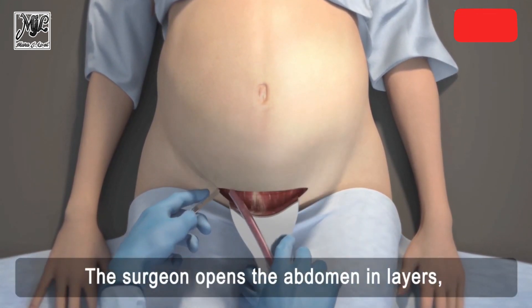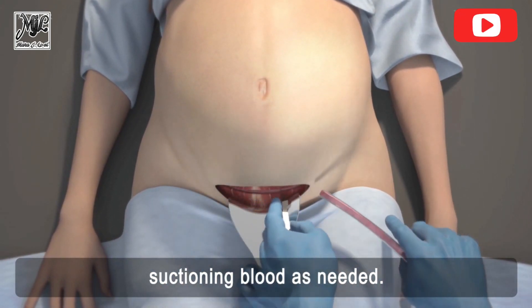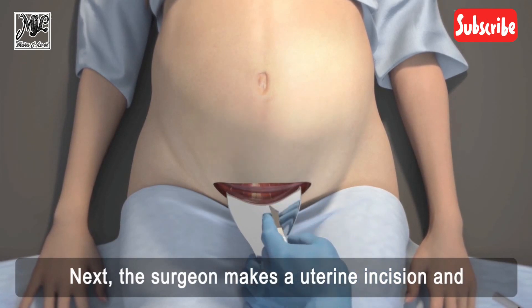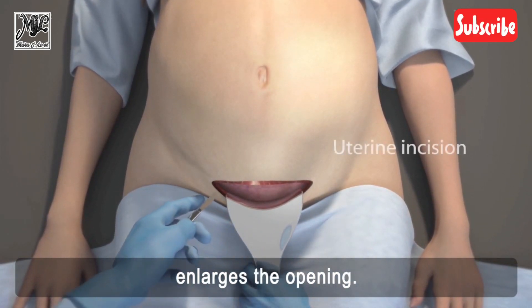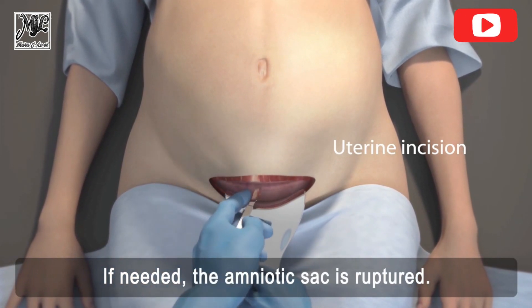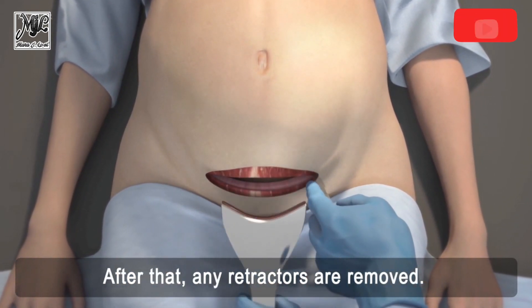The surgeon opens the abdomen in layers, suctioning blood as needed. Next, the surgeon makes a uterine incision and enlarges the opening. If needed, the amniotic sac is ruptured. After that, any retractors are removed.